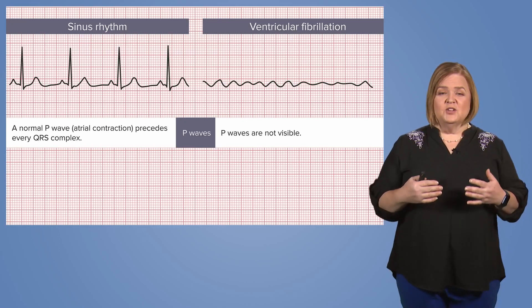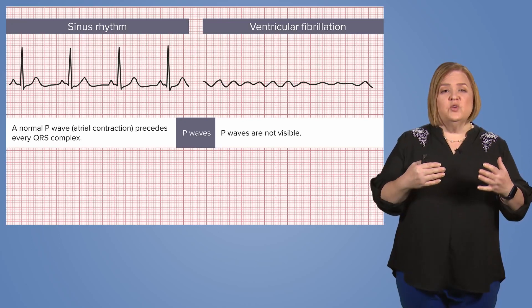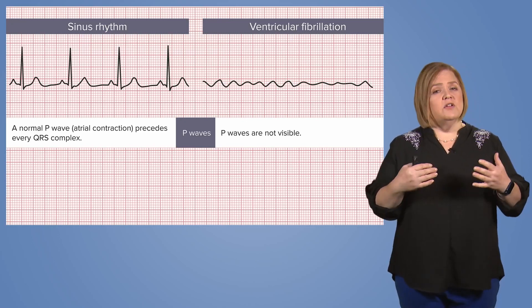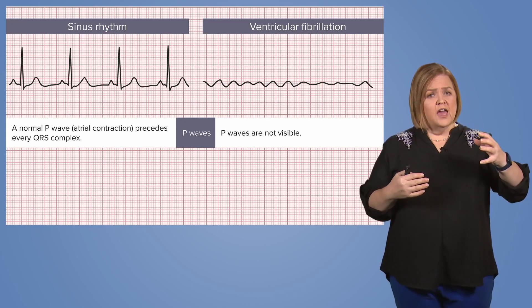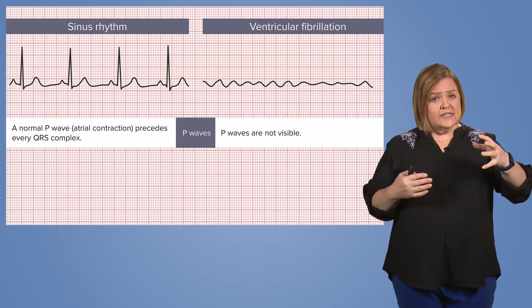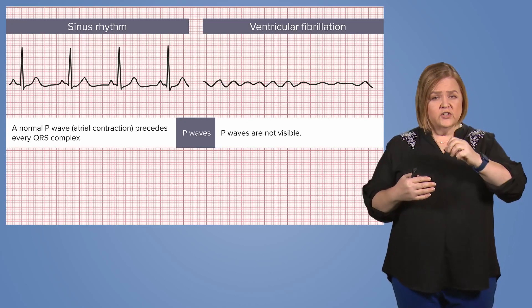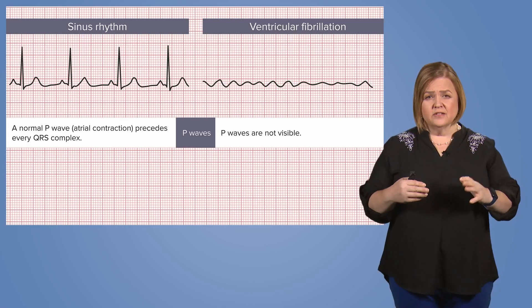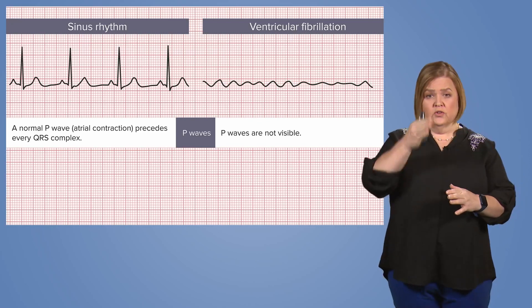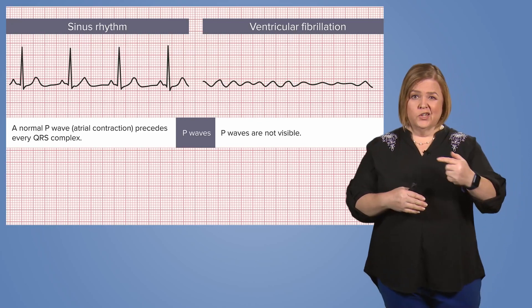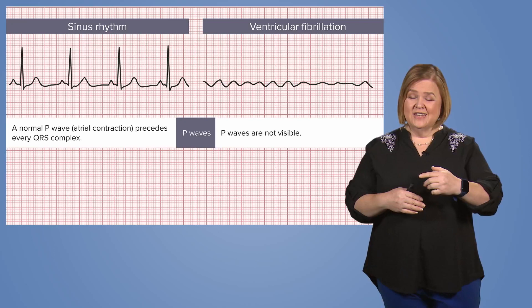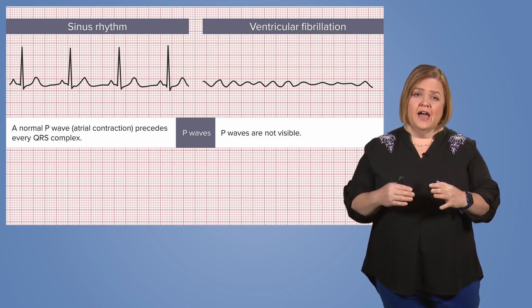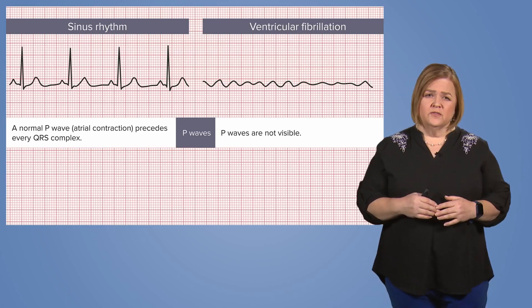to normal sinus rhythm, you'll see that in normal sinus rhythm you have a normal P wave, which means there's an organized atrial contraction, and it happens before every QRS complex, which is the result of the ventricle. In ventricular fibrillation, that isn't happening, so we don't have P waves.